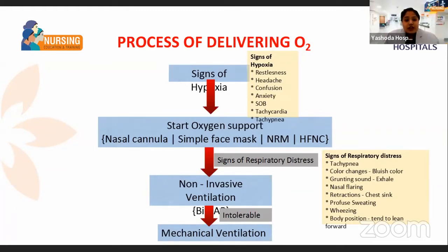So it's very important, based upon the flow rate, we are going to choose the devices. So it's a very important subject now. We are going to start. It's all about the oxygen delivery devices.